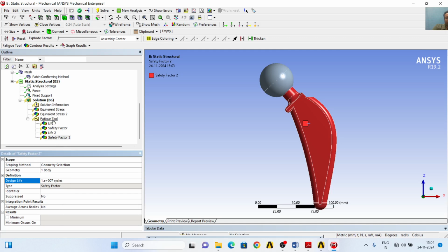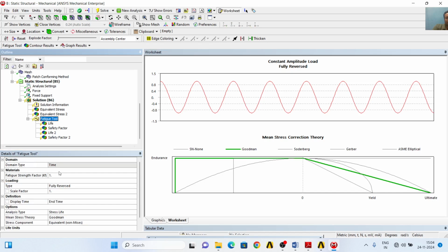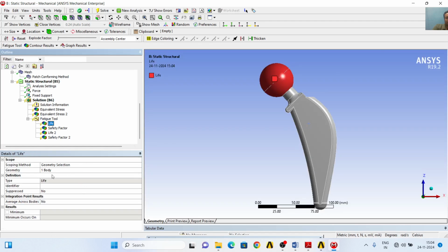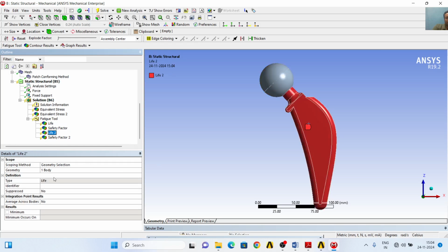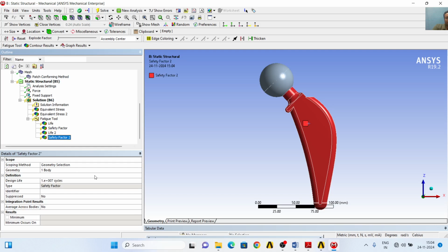Okay, so I will recheck this fatigue tool, stress life, Goodman equivalent von Mises. Okay, life for one body and safety factor for 1e+007 life cycles. Okay, life 2 for this body and safety factor for 1e+007 life cycles. Okay, and I will now solve the solution.